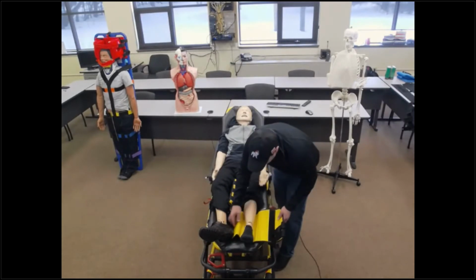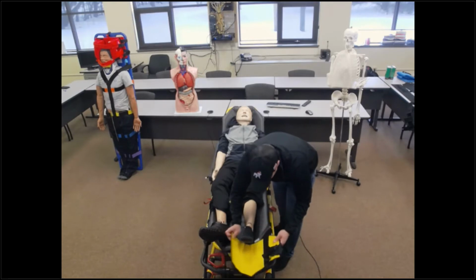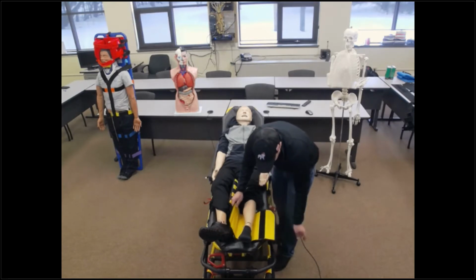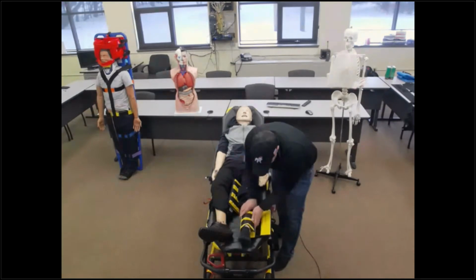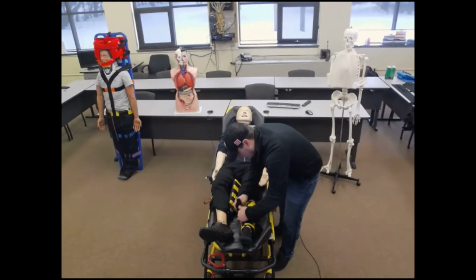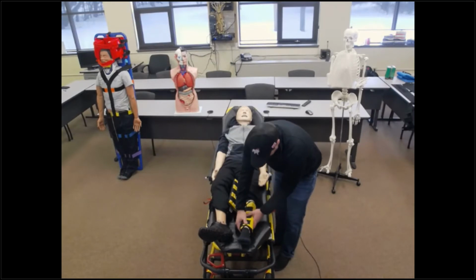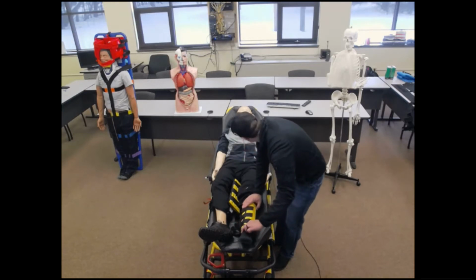So I'm going to check CMS. And what I'm going to do is I'm going to try and slide that underneath the patient. Okay, I got their ankle captured, and then I'm going to go ahead, wrap that around, and then secure it in place. Okay, I got a nice fit. There's no big void spaces at all, and then I'm going to go ahead and reassess CMS.